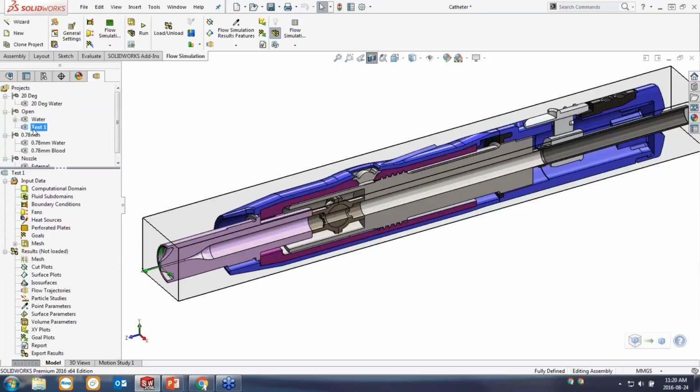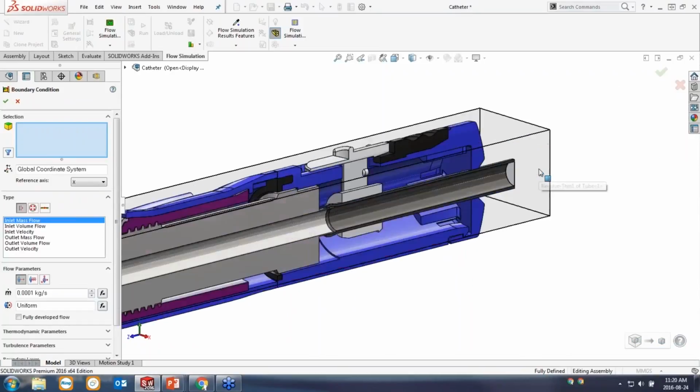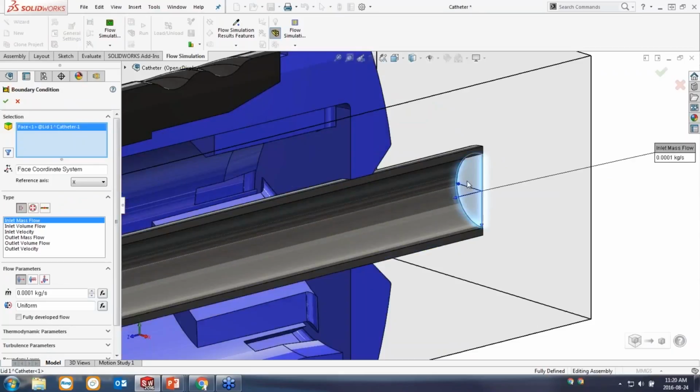So here's my new project that we just created, test 1. I'm going to insert a couple of boundary conditions. My first one is going to be that first requirement. I wanted 5 milliliters per second of flow coming through this device. And so I'm going to apply that at the entrance to the tube. You'll notice that there is a little disc here that I've created. This is something that you need to do when you're running an internal analysis. We call it a lid.